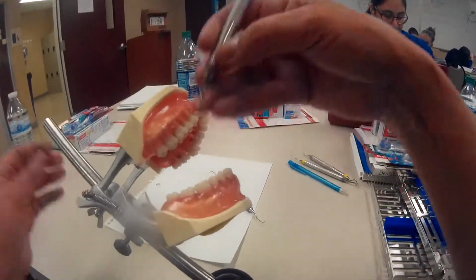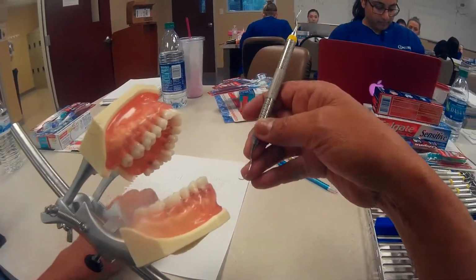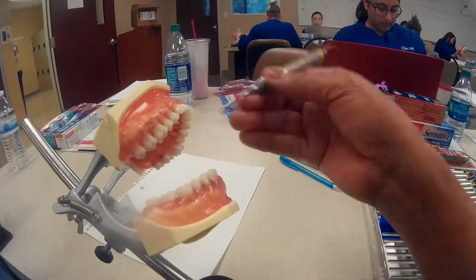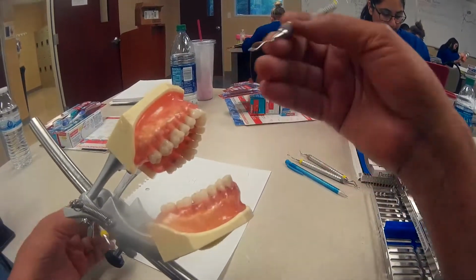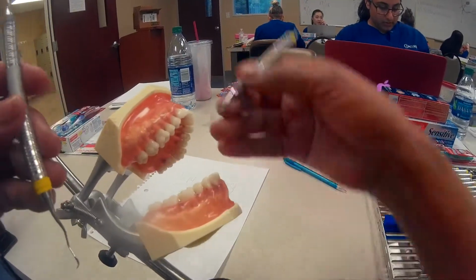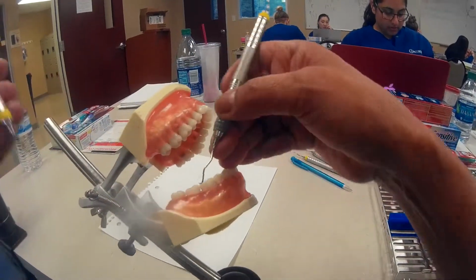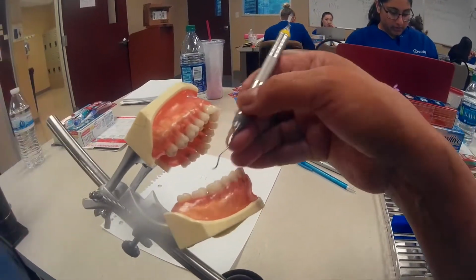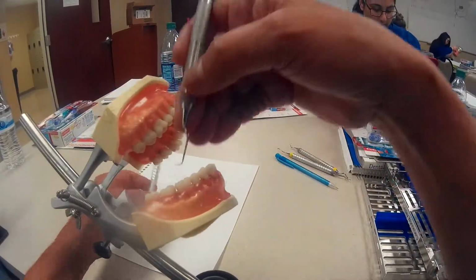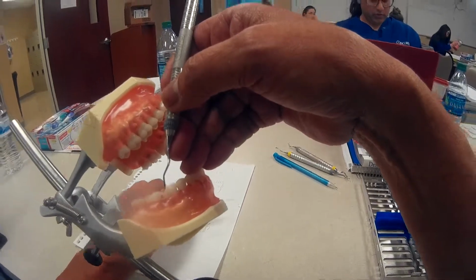Okay, so don't feel like you're not doing the right thing by not picking up the right instrument at first, because as a clinician, that's how you identify the correct instrument, or the more appropriate instrument, by looking at it and making sure that it's adaptable or not. I had a patient one time ask me, why do you keep putting an instrument down and picking up another one? Don't you know what you're doing? I said, no, sir, it's not that I don't know what I'm doing. I've got to make sure I'm picking up the right one.